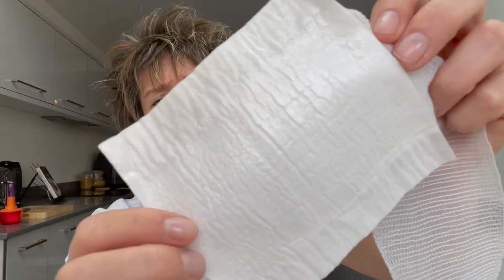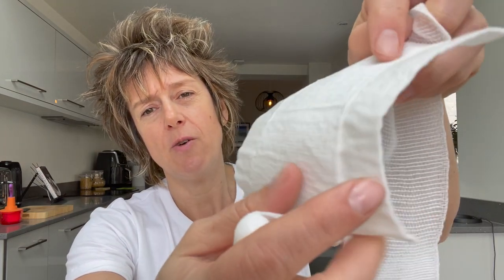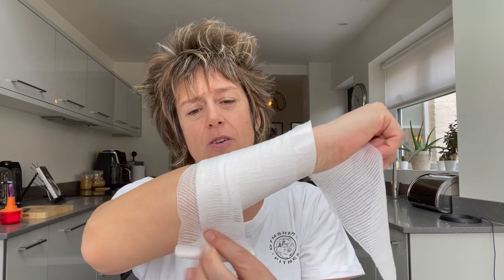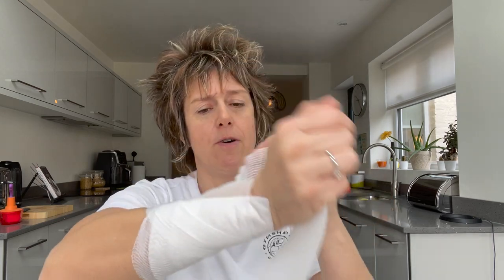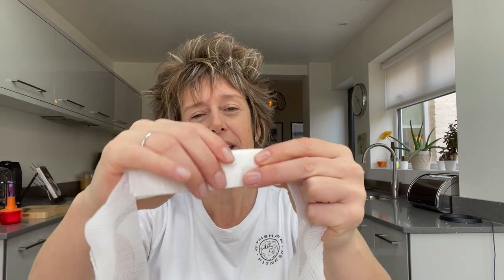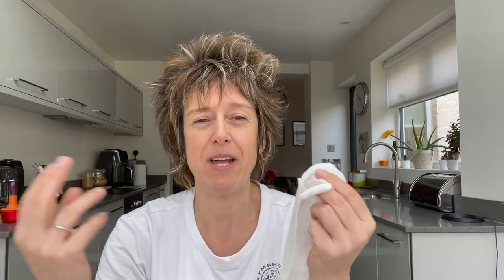This bit of gauze has two sides — you've got a shiny side, and the side the bandage goes over. You don't want to put the bandage side on the wound because it will stick — always put the shiny side on the wound. To apply it: unroll the bandage, cover the bottom of the dressing, cover the top, and just keep rolling it around. Tie a nice bow and the dressing is all covered. I love medium-sized dressings because they're versatile — you can fold them smaller for a head injury or even smaller still. You can cut the bandage off and use it for a mouth injury. It's got the gauze and bandage attached so you're not fiddling around with two separate items.